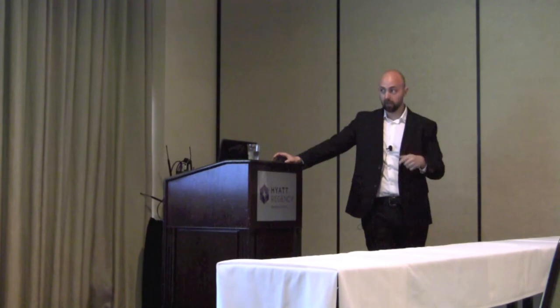And then we have XY compensation, which compensates for growth. An object, when it's being printed, is going to shrink ever so slightly. It's just natural science for resins. But if you have too much light exposing, you have growth. So now the printer has to compensate for that growth from overexposure. It may be a little complicated. If you have any questions, I will be over at the booth next door, and I can give a bit more of a breakdown.